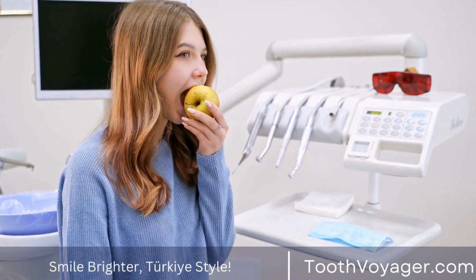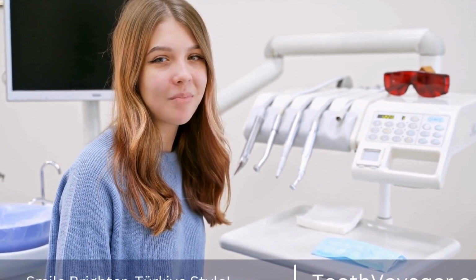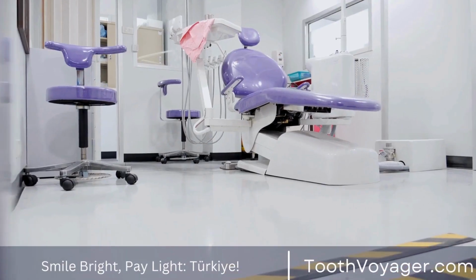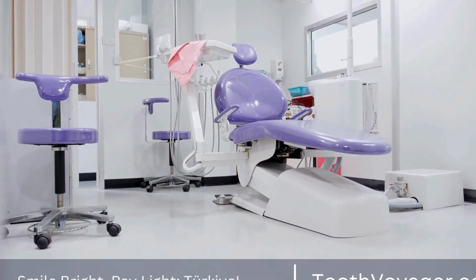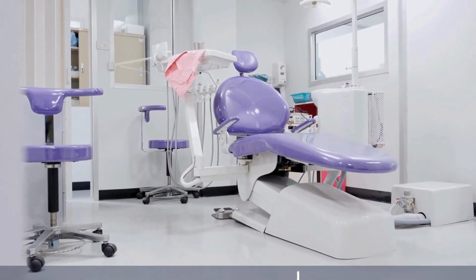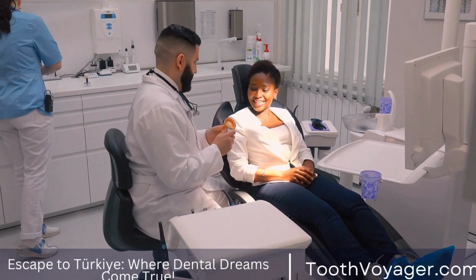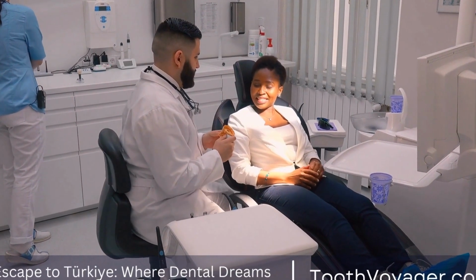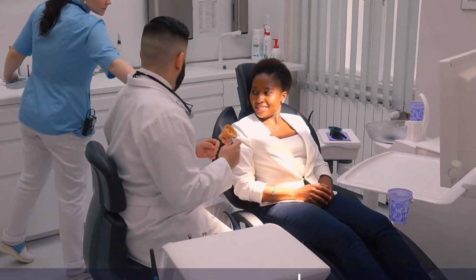Making custom-made dental crowns takes an exceptional level of artistic ability and expertise. Dental technicians need to pay careful attention to the finer details to make sure that the crown is in line with the shape, size, and shade of natural teeth. Also, they must take into consideration the bite of the patient and jaw alignment in order to design an ideal crown that is seamless with the other teeth.